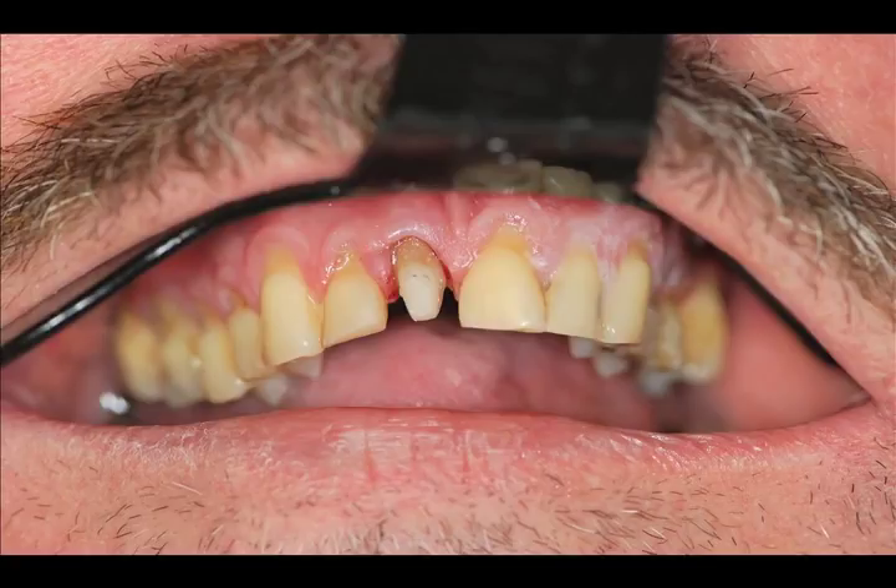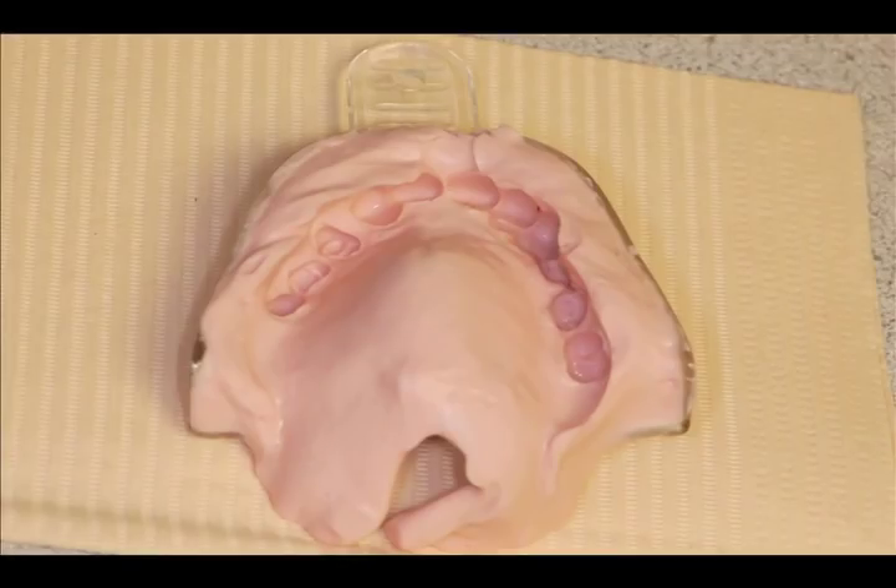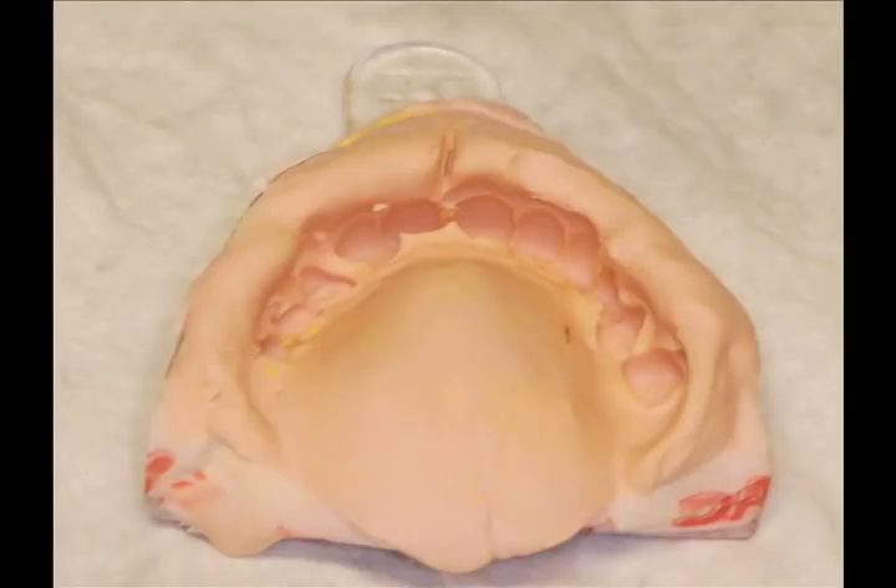The fifth hand lip and cheek retractors are simple products designed by dentists for dentists. The fifth hand is easily placed inside the upper or lower lip to allow easy placement of the impression tray or retraction for digital photographs. One of the flaws or problems with dental impressions is the patient's lip catching the inside of the tray and eliminating the seating of the tray over the teeth.